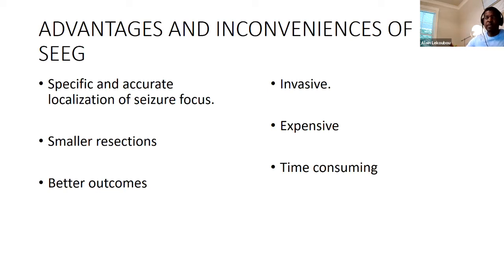It's invasive because, no matter what, it's someone's brain. You're sticking those things into someone's brain. It's invasive. It's expensive, okay? It's a lot of money, and it's also time consuming. I can tell you, it can take you a whole day to read the entire recording.